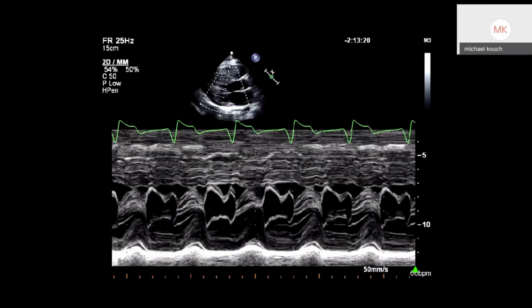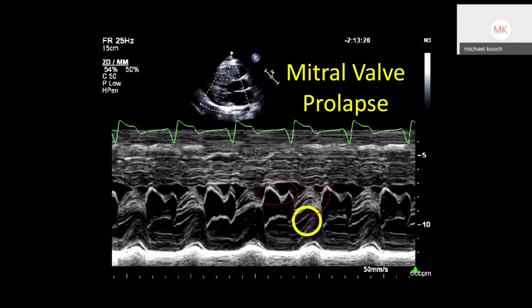All right, so here's that same image, right? Normal diastole and evidence of SAM. If we look through here, you see this little yellow marker here. We can look at the next image. Do you see that this posterior leaflet has no coaptation with the leaflet that moves up against it? So you actually also see some prolapse of the mitral valve in that region. So you may actually have some mitral valve regurgitation during that same period.